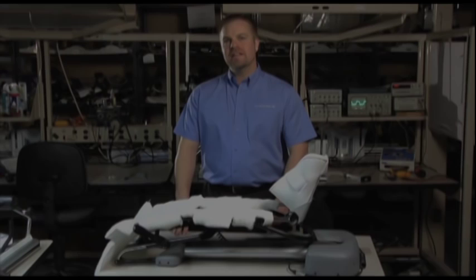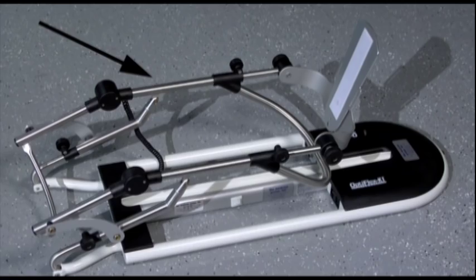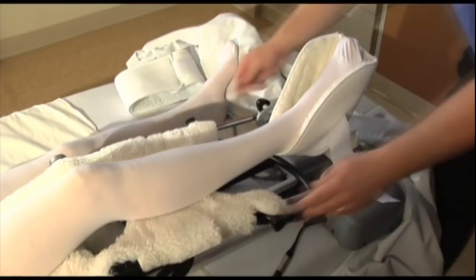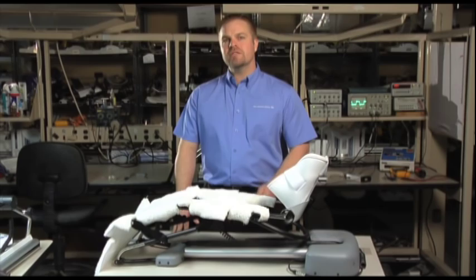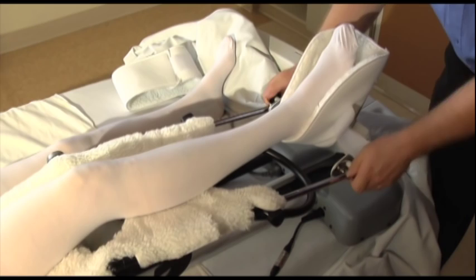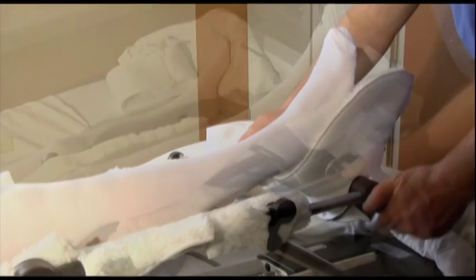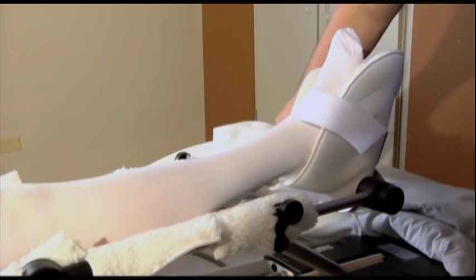The components of a CPM machine are the hand control, the orthosis or leg carriage, a power cord, an on-off switch, and the foot plate. The adjustable sliding parts of the CPM machine are used to properly fit the length of the patient's thigh, the length of the lower leg, the flexion and extension of the patient's foot, along with adjusting for internal and external rotation.